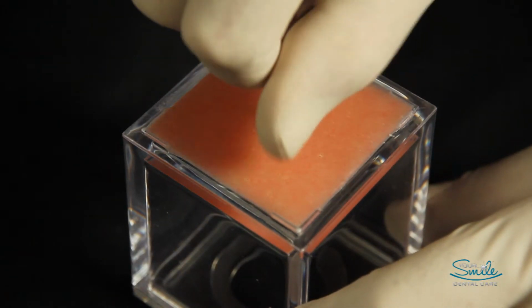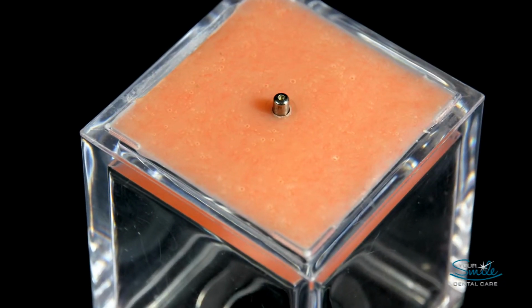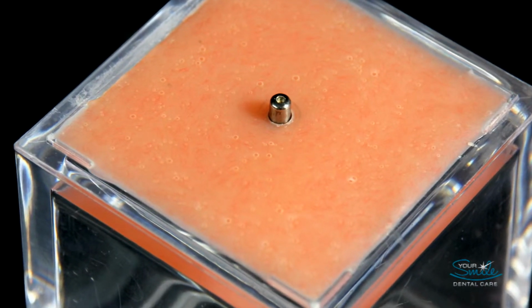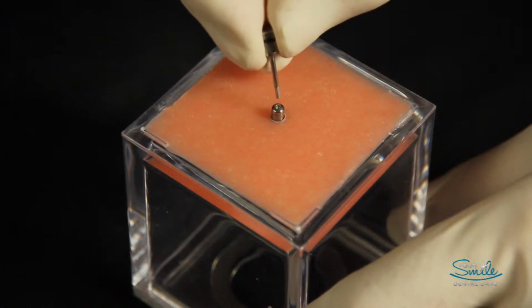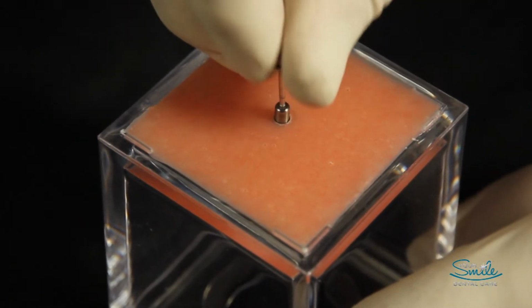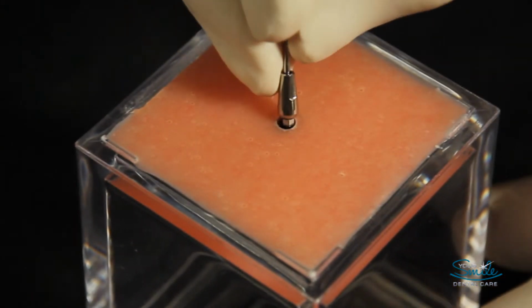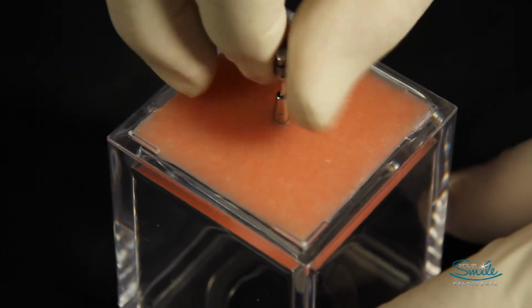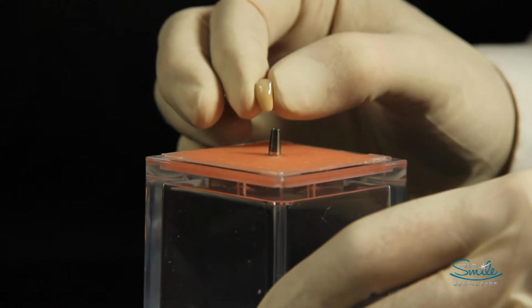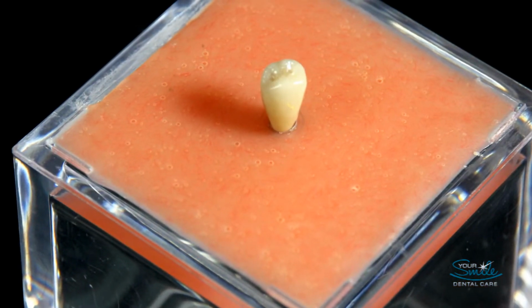healing abutment is attached to the implant to hold open the gum and allow it to form ideal contours for a couple of weeks. The same as a keeper does for ear piercings. Any procedure beyond this will no longer require any freezing, as they are totally comfortable, the same as changing earrings. 2 weeks have now gone by and the gum has healed nicely. We then remove the healing abutment, insert an appropriate final abutment, take impressions, fabricate a permanent crown, and then insert it into place, providing a permanent tooth replacement that could very well outlast the patient.